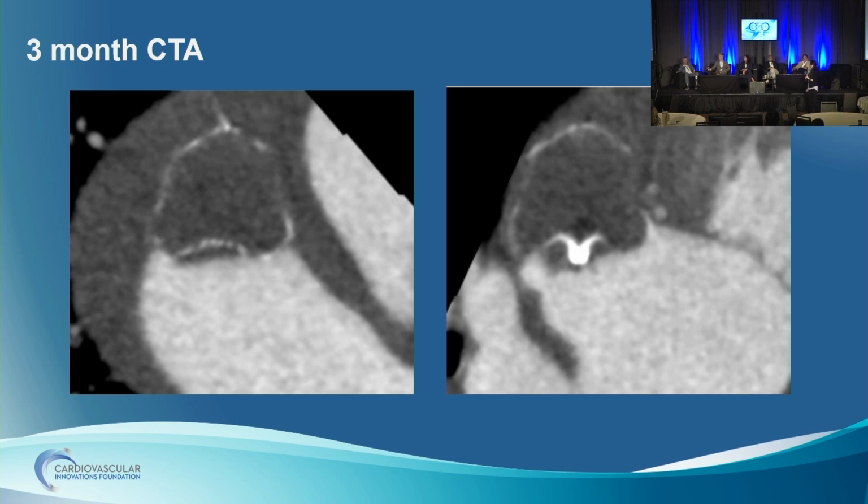Jason's side, he's thinking, well, it's dramatically improved. Yeah. I would say 90% of it is resolved. And now you just see a little bit around the hub, which can be normal. What you're seeing is the metal frame, but the fabric actually goes to the tip of the hub. So that density around the hub may actually be beneath the fabric. This actually looks pretty good to me. I'd like to spin it and see all the other views.